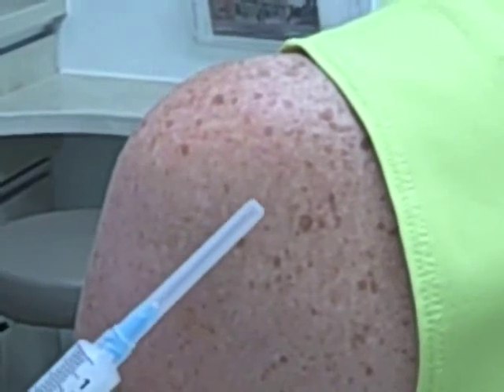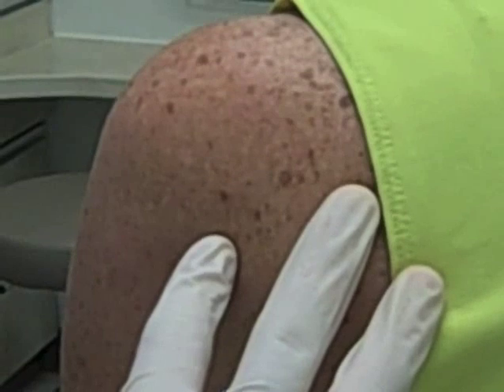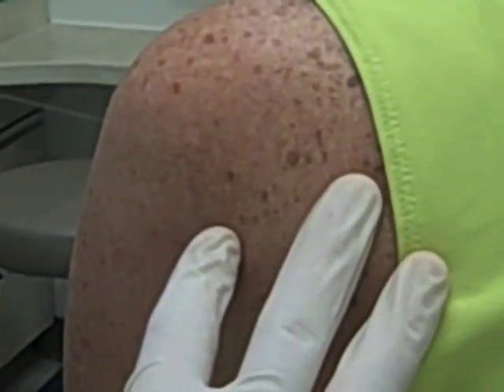We use ethyl chloride spray for local anesthetic. We spray the skin for approximately five seconds, spraying from around six inches away from the site of the injection.